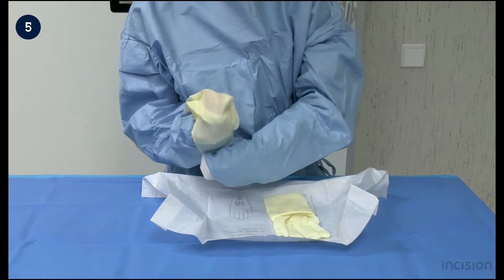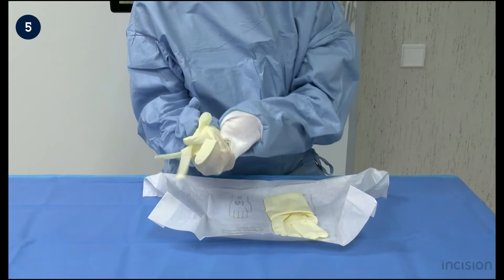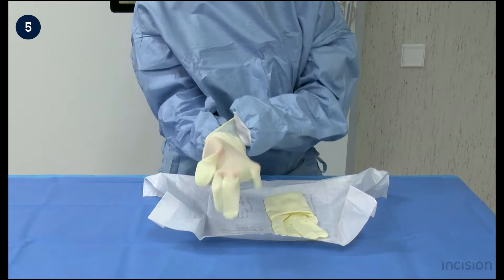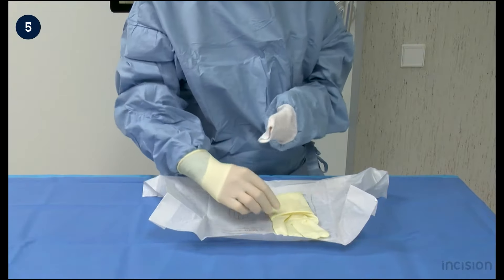The right hand takes the folded border of the glove. The left hand takes the other side and pulls it over the hand. The lower edge of the glove is pulled to proximal as the hand and fingers maneuver themselves into the glove.